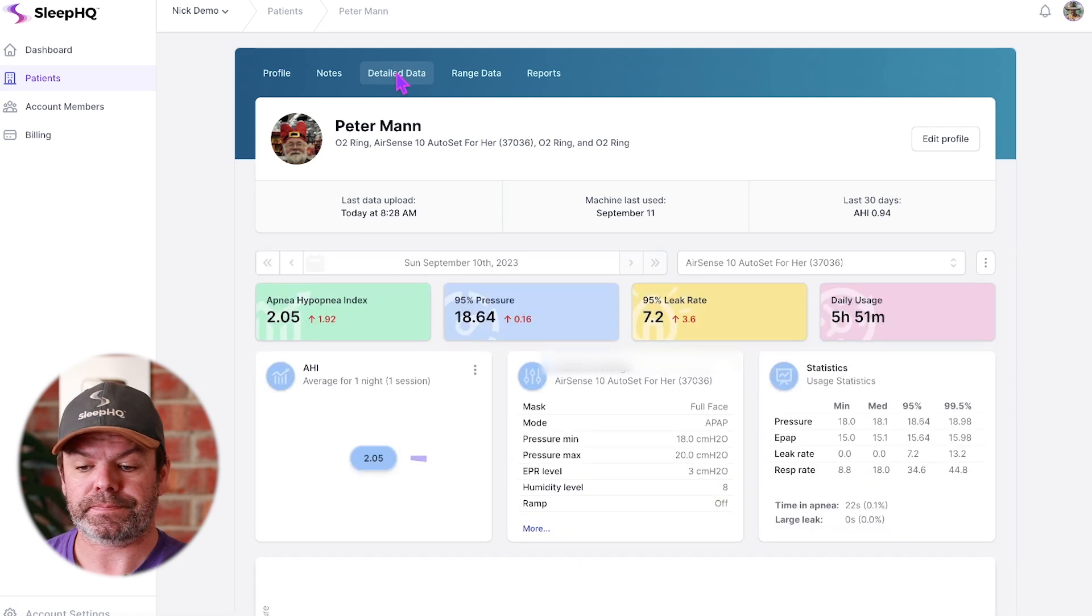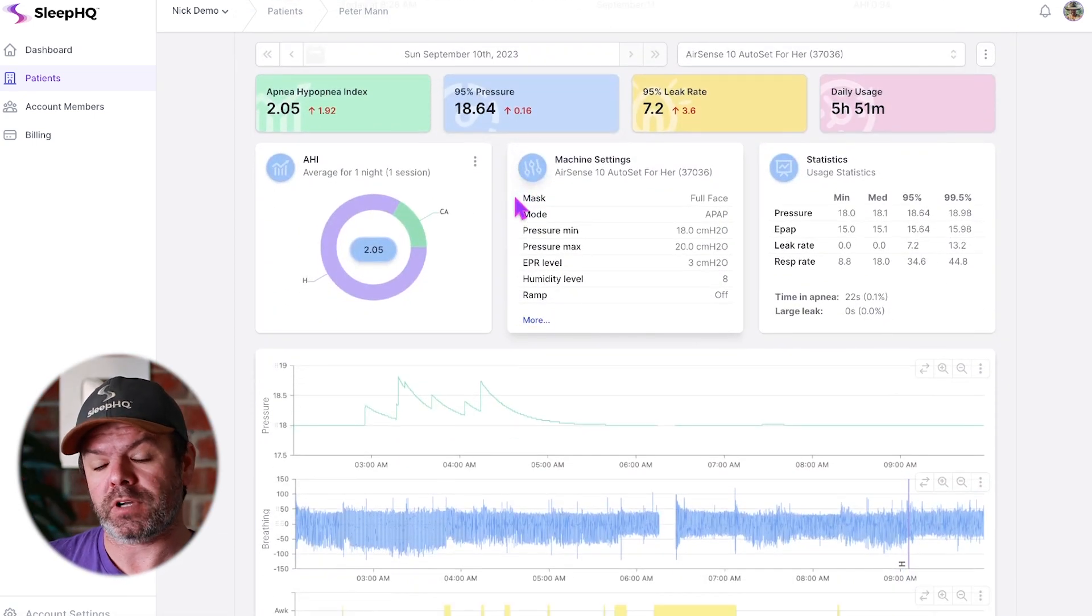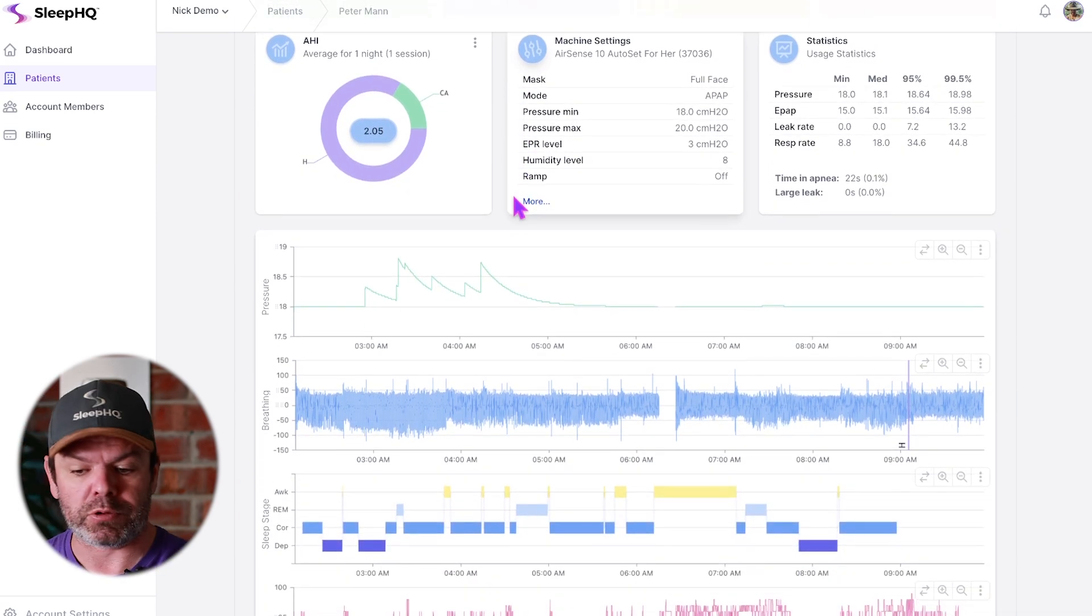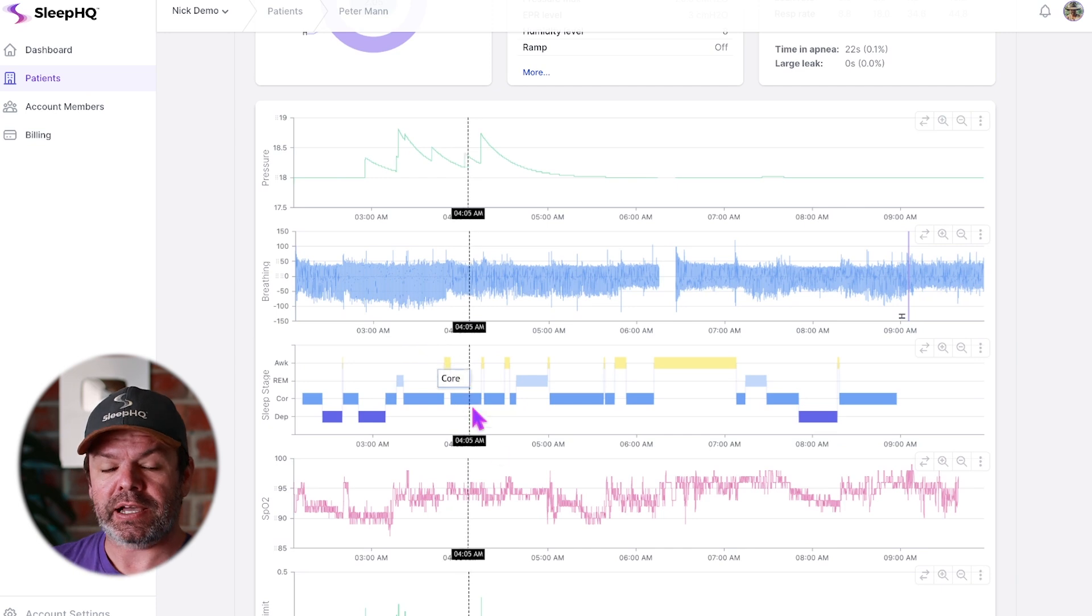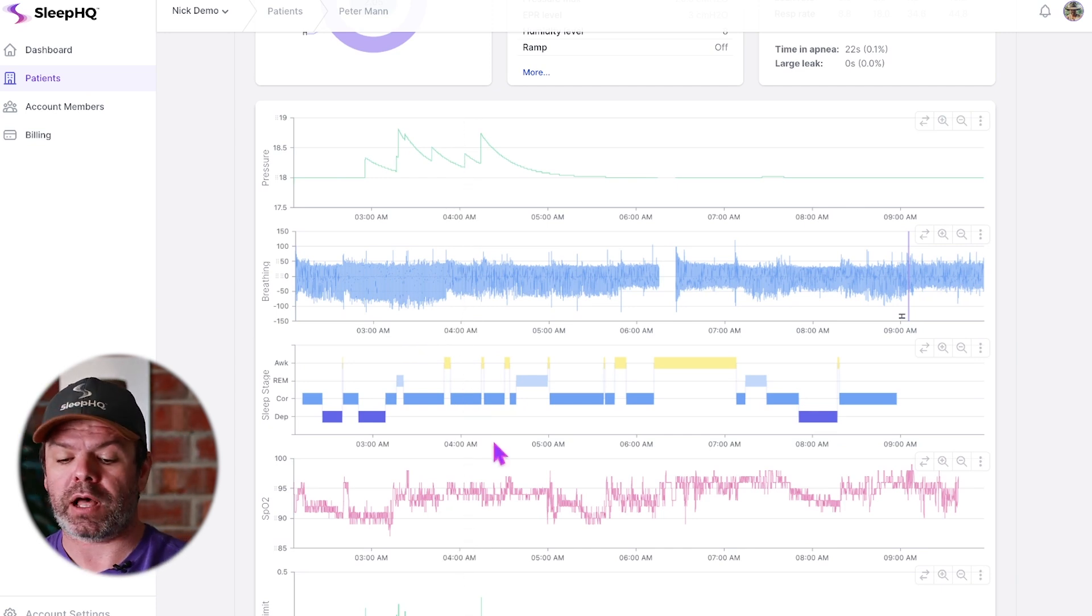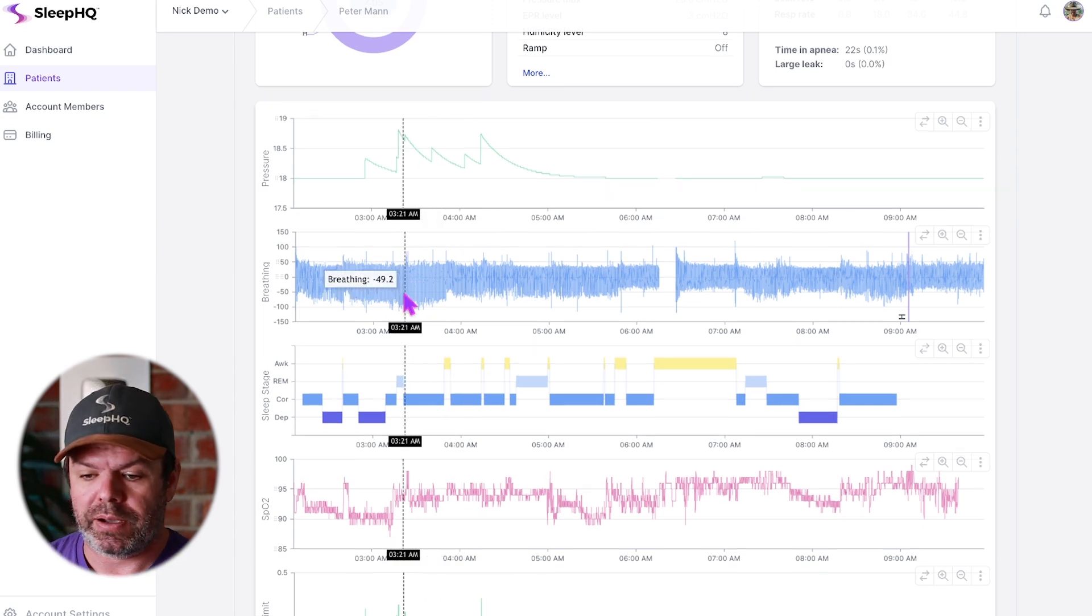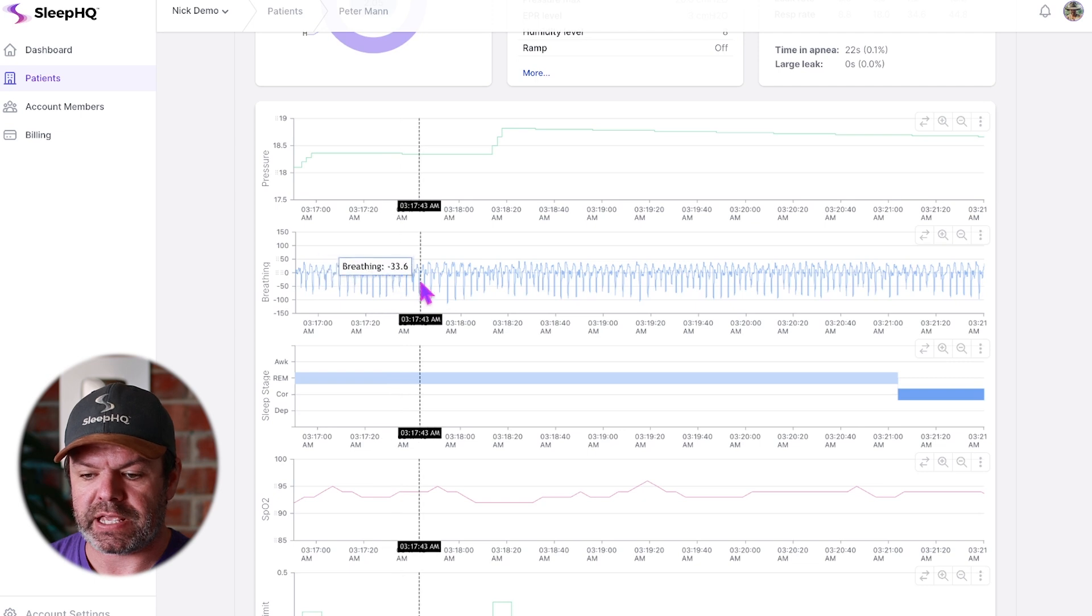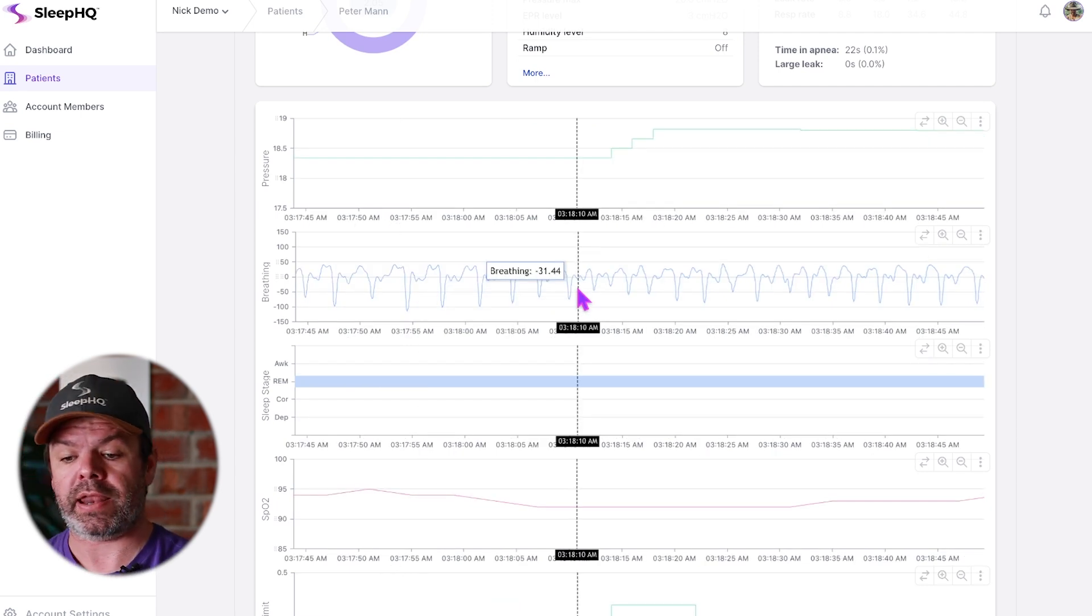Let's check out Peter's detailed data. Come over here to detailed data from last night. Got all the information I need right here to make good clinical decisions. I've got his sleep stage data here, his blood oxygen levels. Peter's obviously a pro member because he's syncing up Apple Health. He's got his Sleep HQ O2 ring. I can zoom in here during REM and see every breath he's taking in high resolution, which is really handy.